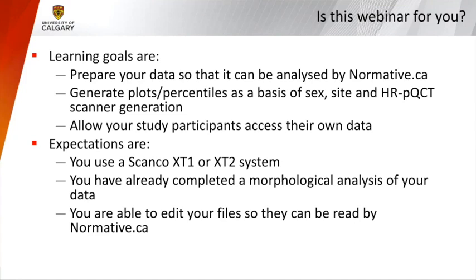So the expectations are that you use a Scanco first or second generation HRpQCT system, XtremeCT system, that you have already completed a morphological analysis at your site to measure things like trabecular thickness, etc. So that's all done. And that you know how to edit a file, that you are used to basic editors or at least to use Excel.